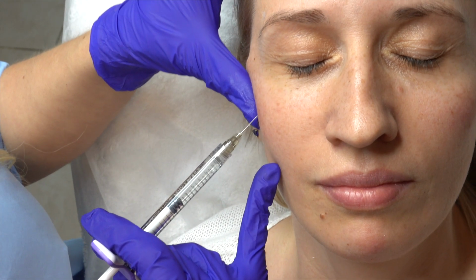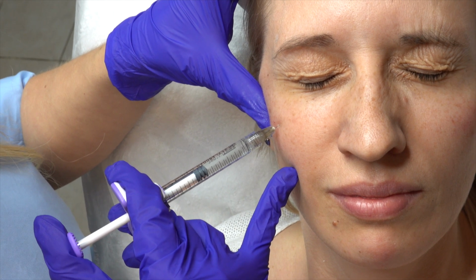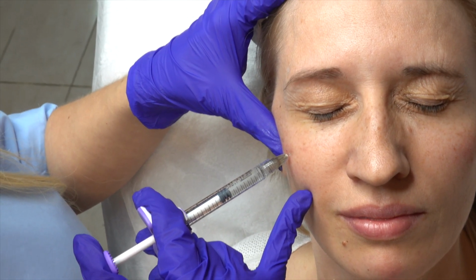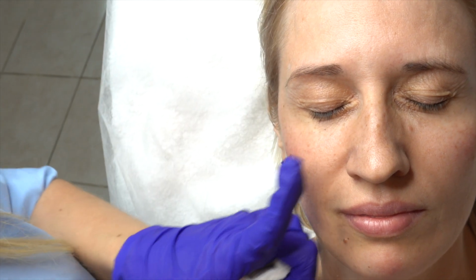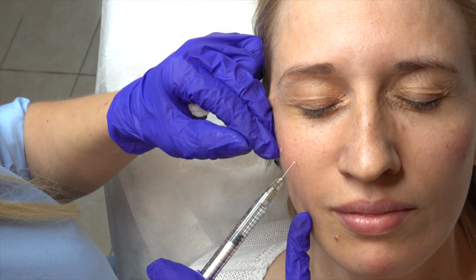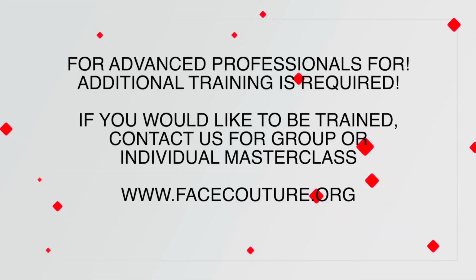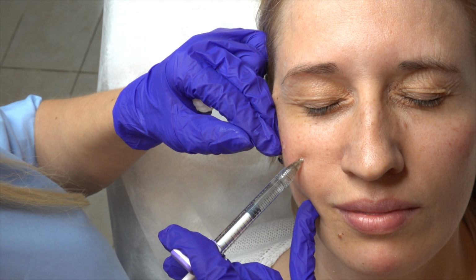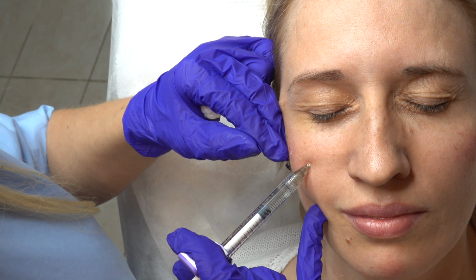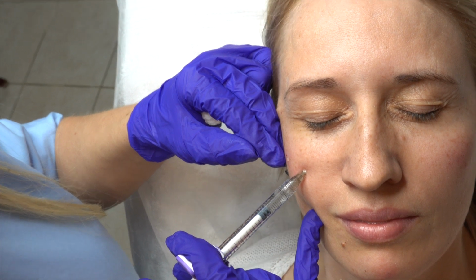Now this second point to support the ligaments, again 0.2, and here to the midface groove. To support this ligament also 0.2. Done.